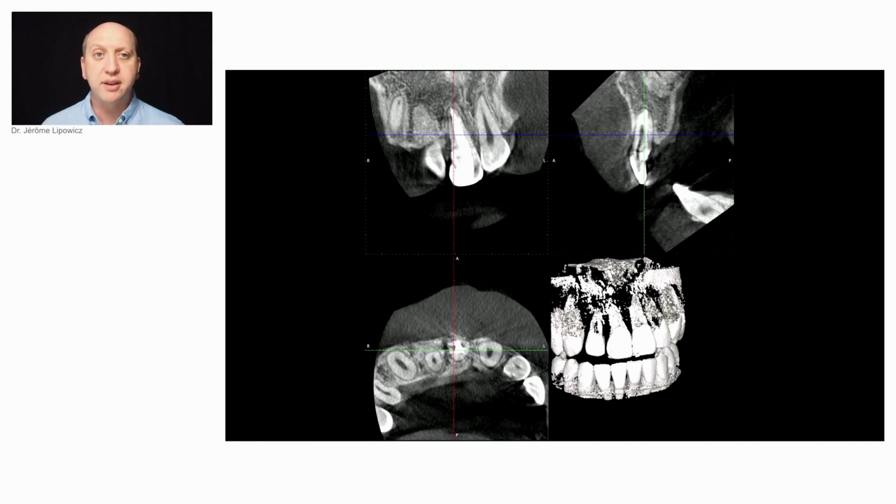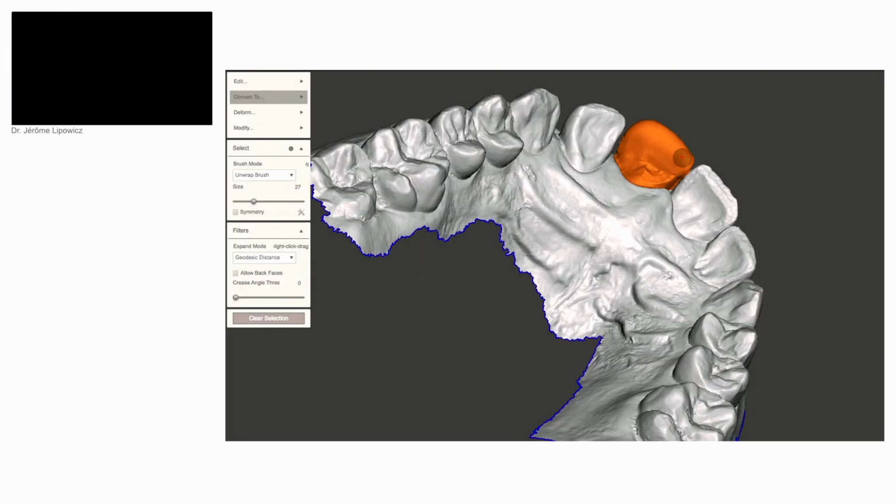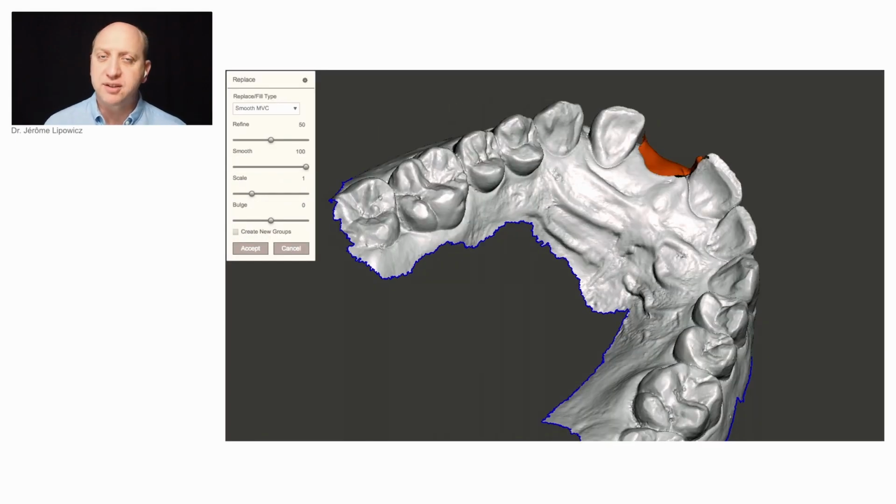We do the X-rays and a CBCT, and we find out a tooth fracture that is accountable for the distal periodontal issue. So the tooth is lost. So the first thing I do is I grab my intraoral scanner and think about an implantation with an immediate loading. I do the virtual extraction that is done with Meshmixer, which is a free 3D editor you can download. You can still download it. I think it will soon be replaced.